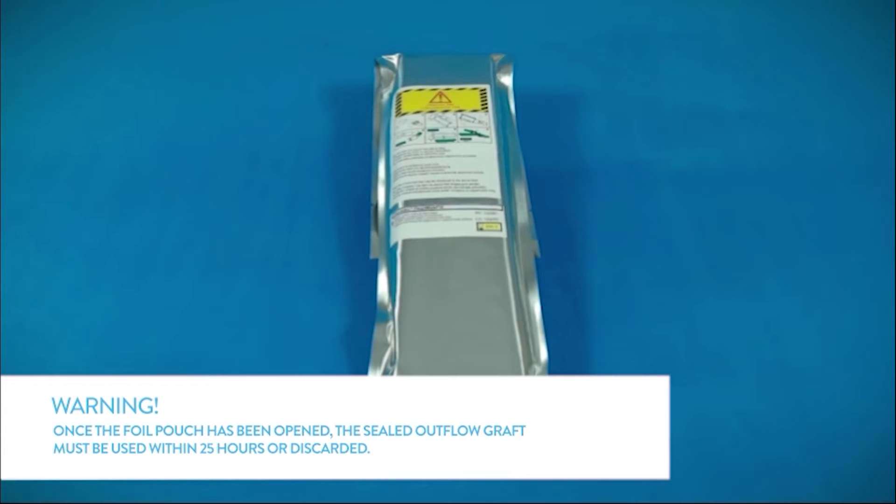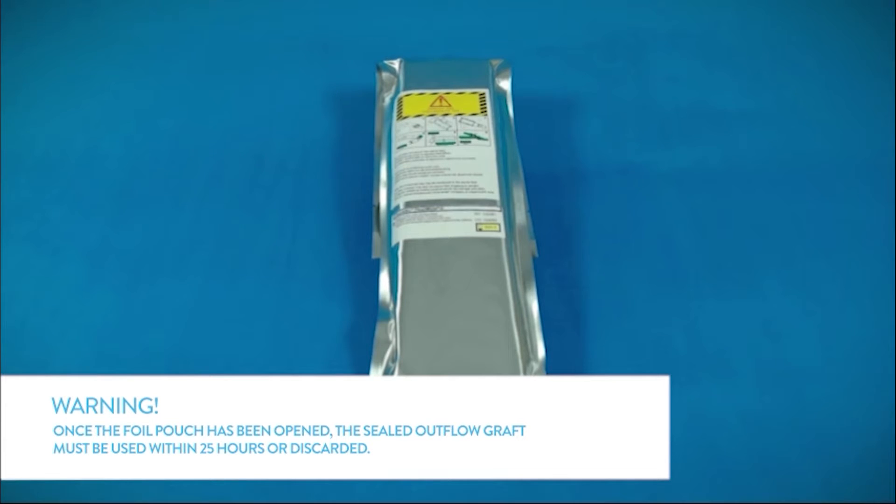Warning: once the foil pouch has been opened, the sealed outflow graft must be used within 24 hours or discarded.